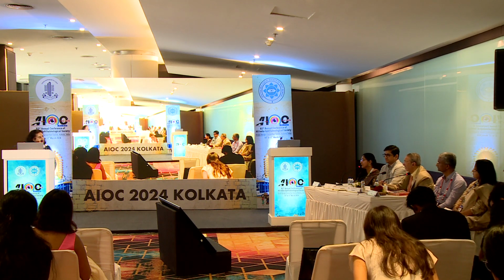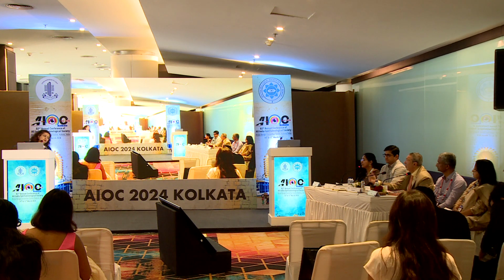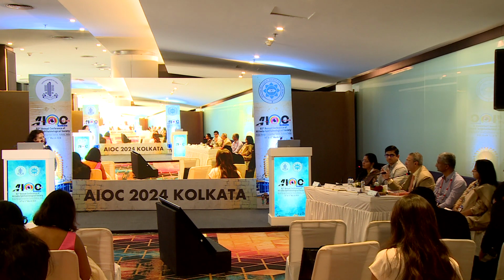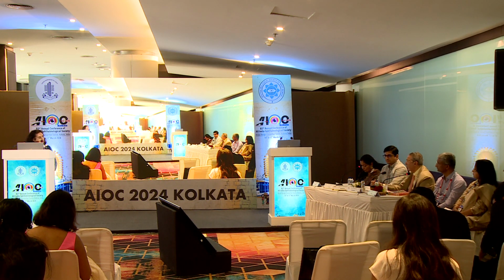What will prevent it, as was said, is mannitol, which you are giving, and putting a Flieringa ring so that you can keep the sclera open. These things will help more. This is more for psychological help and ready availability of tissue to close down. And as you said, you can take 2 sutures first. I normally take 3 sutures and then cut off the hinge because the hinge is small. Only the 4th one I take after chopping off the hinge.